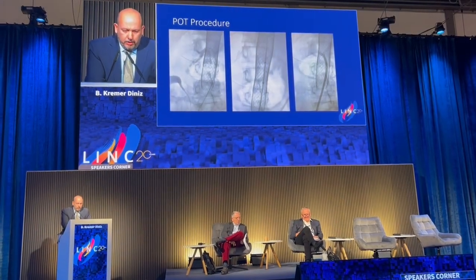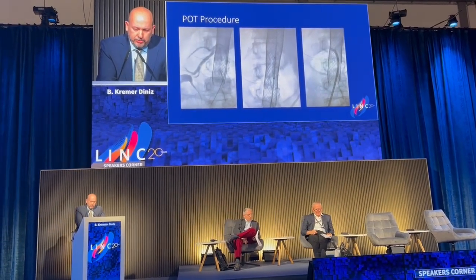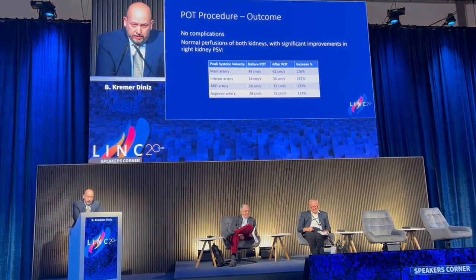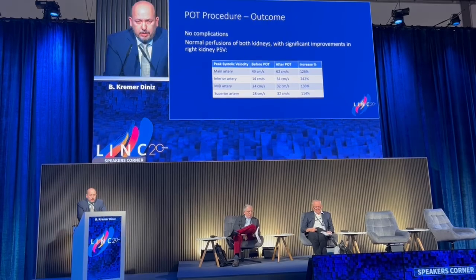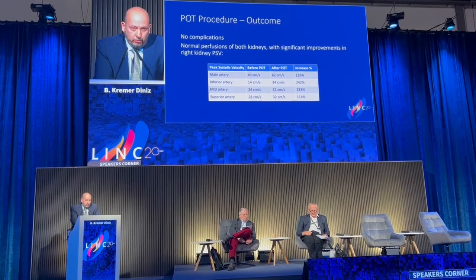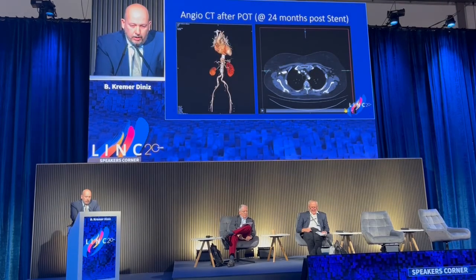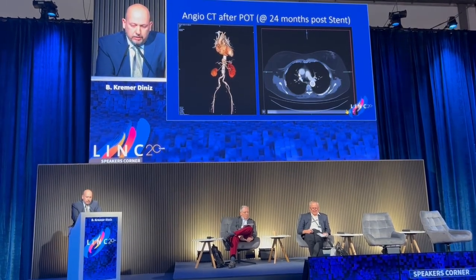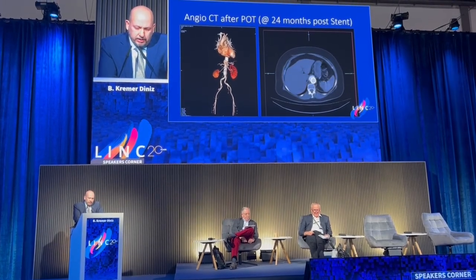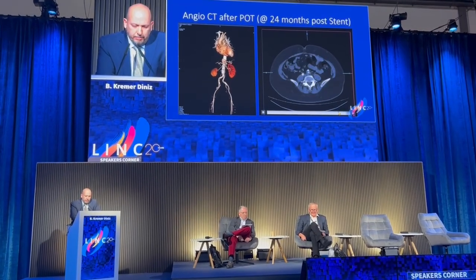It's very simple. Here, no renal stenosis. Inflate the balloon, and after the procedure, again, no complication, no stenosis at the renal. After the procedure, we did again a Doppler, and we can see a robust increase of the flow to the side branch, to the renal, as you can see here. After 24 months, we keep the good results, and the perfusion of both kidneys is the same, good, like you can see here in the contrast uptake.